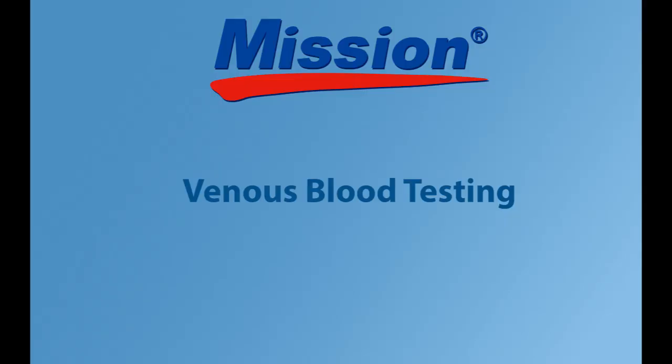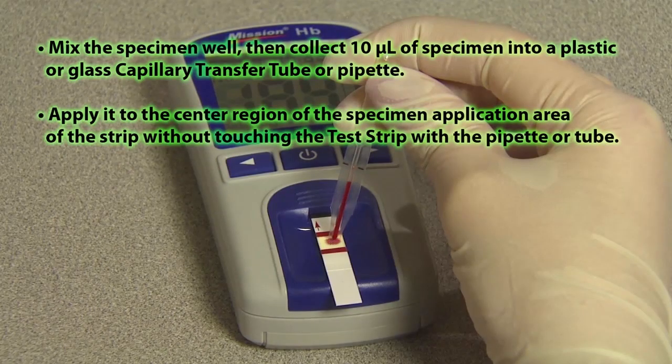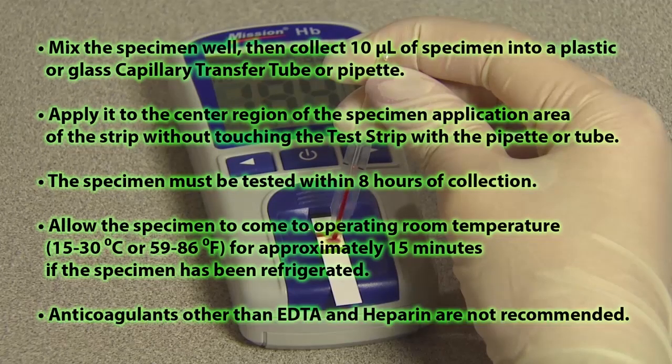Venous blood testing. For professional testing using fresh heparinized or EDTA venous whole blood, serum, and heparinized plasma. Mix the specimen well, then collect 10 microliters of specimen into a plastic or glass capillary transfer tube or pipette. Apply it to the center region of the specimen application area of the strip without touching the test strip with the pipette or tube. The specimen must be tested within eight hours of collection. Allow the specimen to come to room temperature for approximately 15 minutes if it has been refrigerated. Anticoagulants other than EDTA and heparin are not recommended.